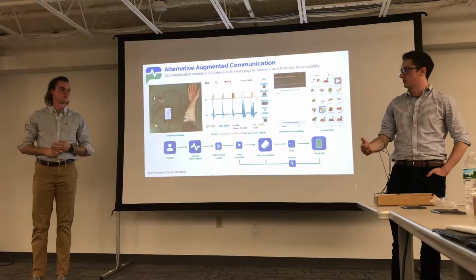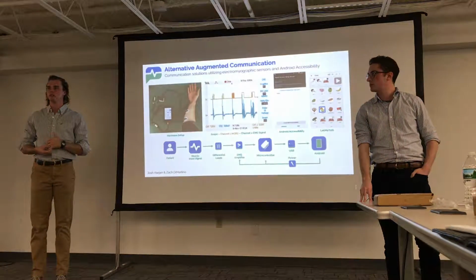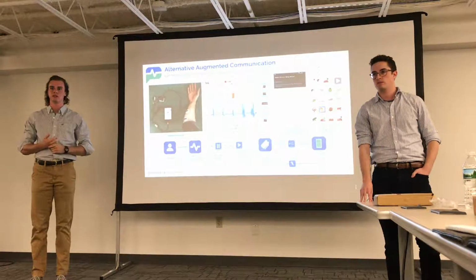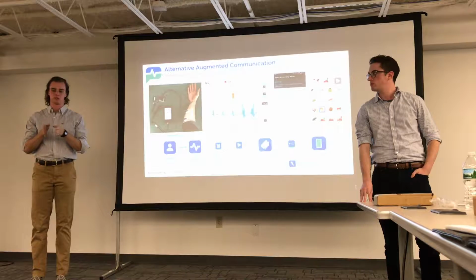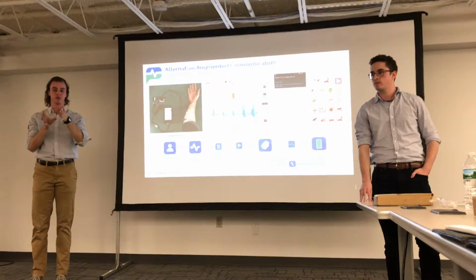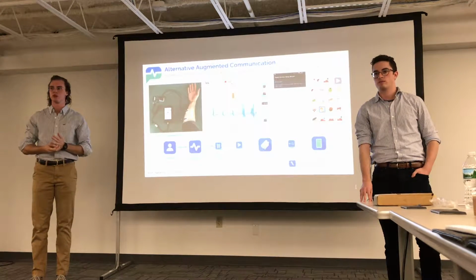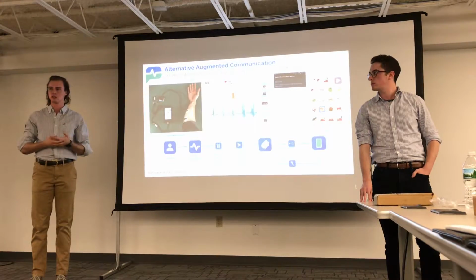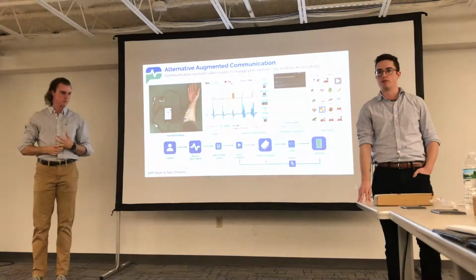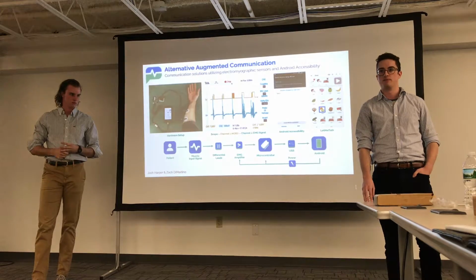Yeah, we've struggled to find one. There are existing EMG controller devices, but none of these devices are plug and play, and they can't use the full functionality of their phone. A lot of these devices are used specifically to control a wheelchair, running a built application just for that device. This unlocks all the capabilities of your smartphone so that the patient can function totally normal. Yeah, they can read emails, surf the web, anything you'd be able to do on a normal phone, they'd be able to do.